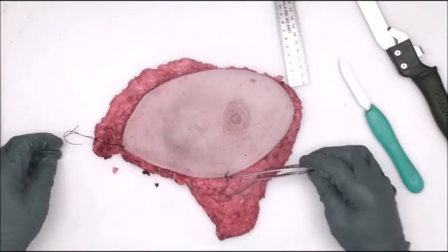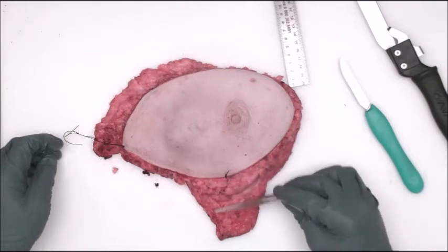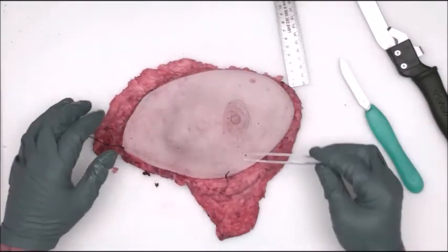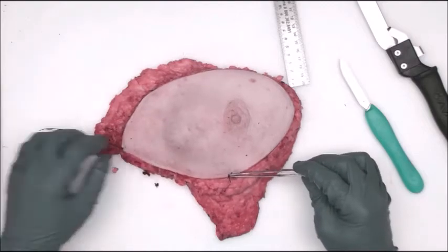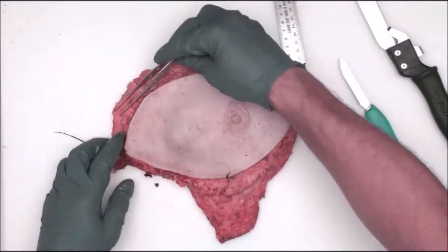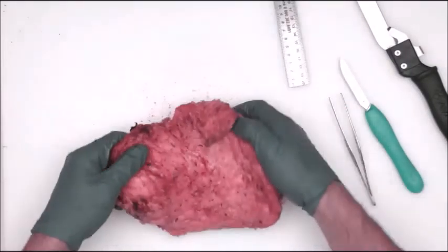Now, as you can also see from the appearance of this breast, there's more breast parenchyma here than there is at the inferior aspect. So if you were not to have any sutures here or here, you could probably still go ahead and orient it, which is based off the amount of breast parenchyma here and the very little down here. Let's turn it over to the posterior aspect.